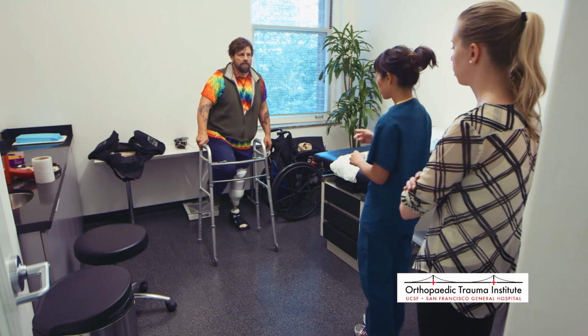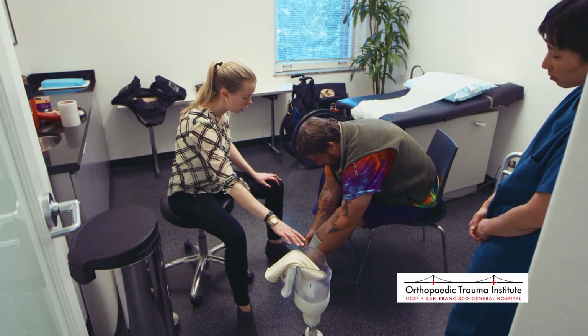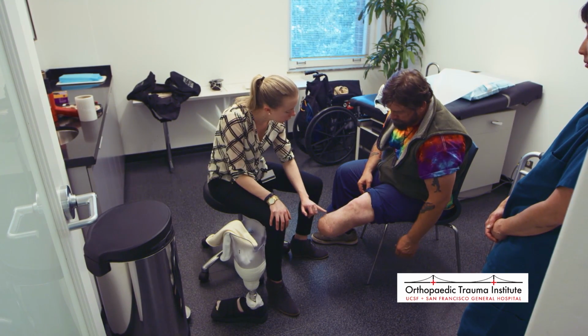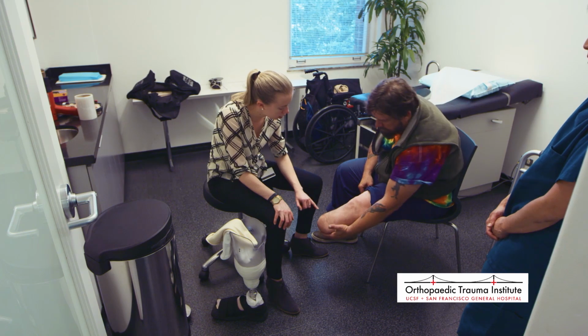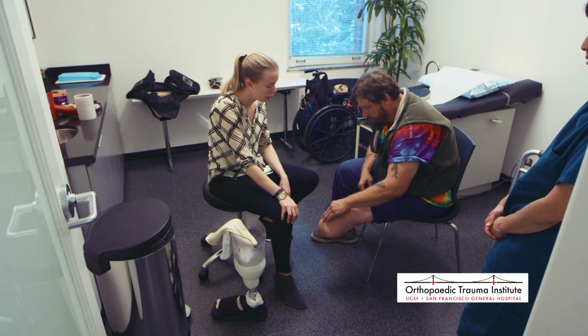While Don was able to get on his feet for the first time since the accident at this appointment, Hannah will need to take the test socket back to the lab for some minor adjustments so that it will better fit Don's residual limb. This is common, as a test socket will often have to be altered several times before the best fit can be achieved.